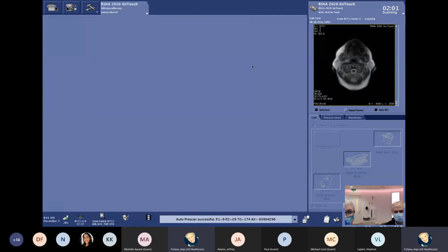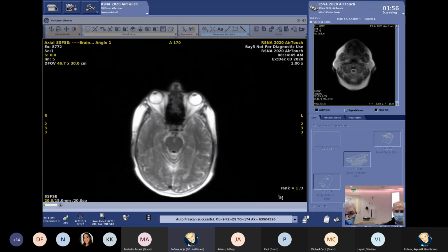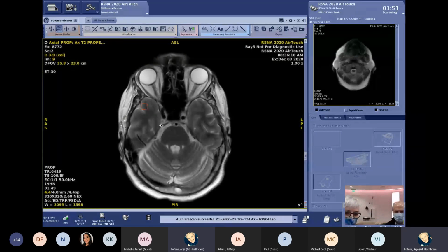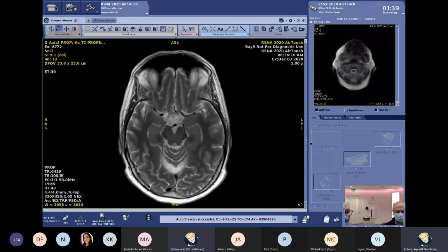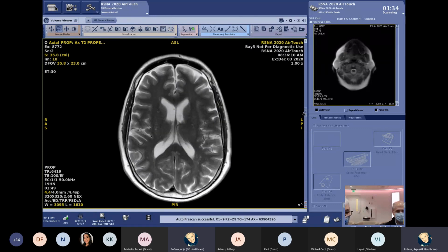I will launch the 3D volume viewer. And here are the first T2 images acquired. I forgot to mention that we acquired a PROPELLER technique, so these are motion corrected sequences. So in case the patient had some motion, we wouldn't have to worry about that. The scan was only 1 minute and 49 seconds, and we have the entire brain covered with 4 mm slices and a good in-plane resolution here as well.